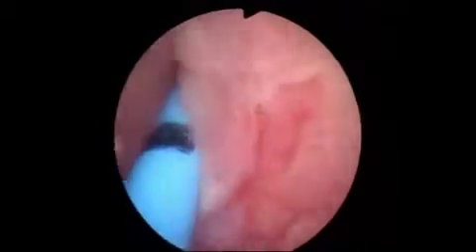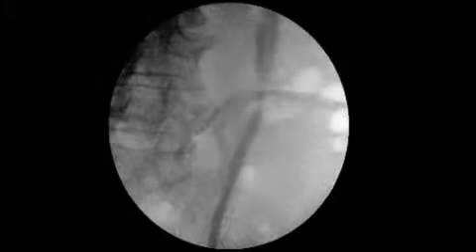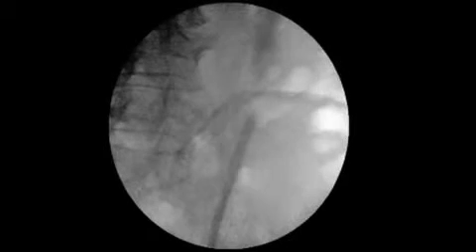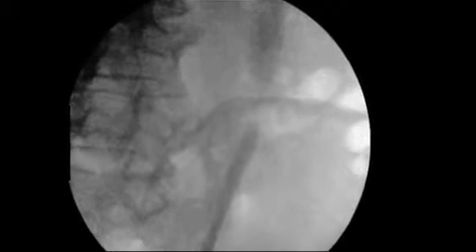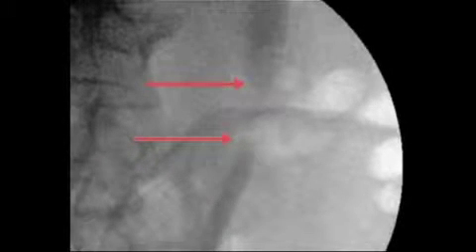Now we're getting ready for the retrograde pyelogram. As you can see here, this is the ureteric orifice, and we are doing the retrograde pyelogram at the moment. And as you can see here, this is the level of the stricture. These are the two levels that the stricture has been marked, the proximal and distal end of the stricture.